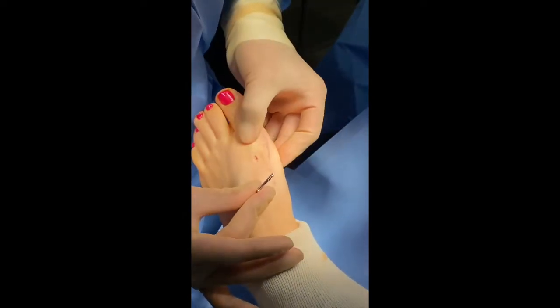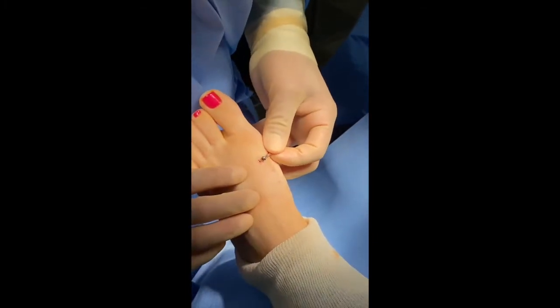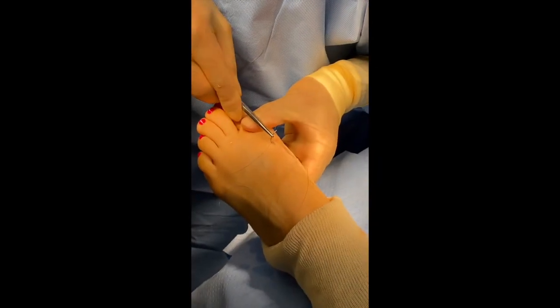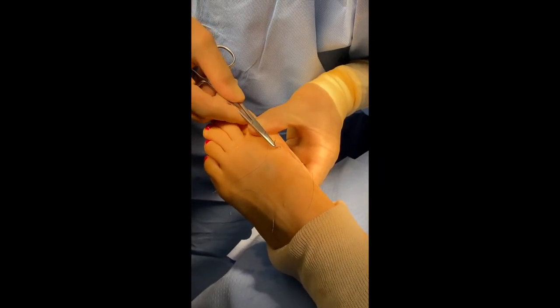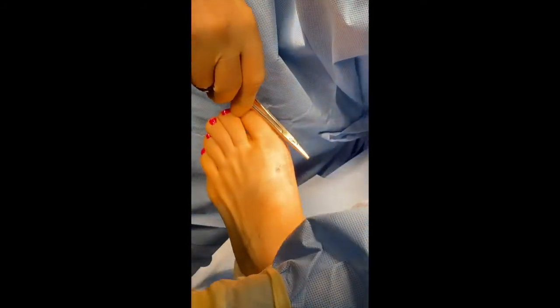We will then irrigate it. And then all you need to do is put one small stitch over that incision and we'll bandage it up.